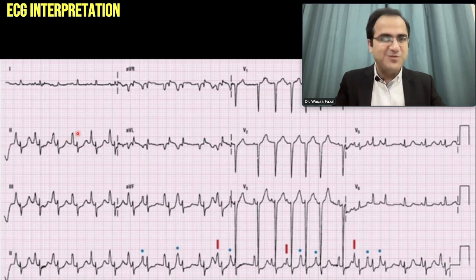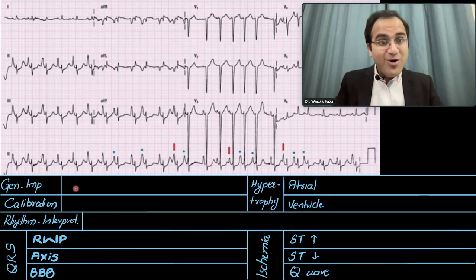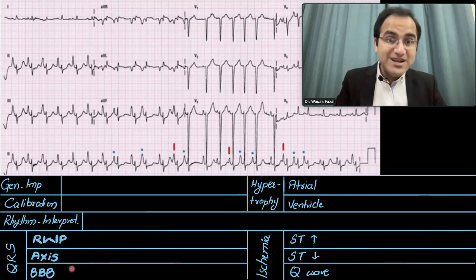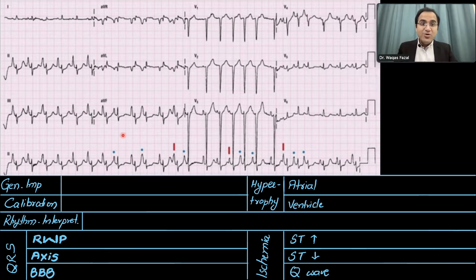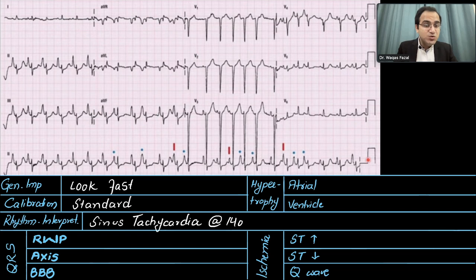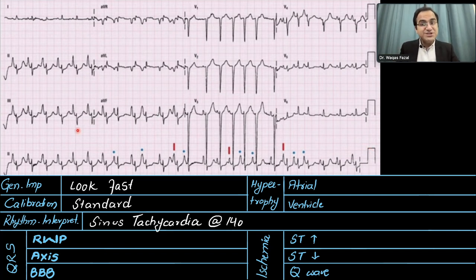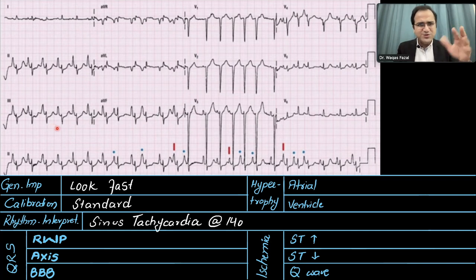Now we will practice some ECGs. In this ECG, there are clear-cut tall peaked P waves. We will solve the ECG by the six-step method. Coming to the general impression, the ECG looks fast. Looking at the calibration, it should be two large boxes tall and one large box wide, which is the case — so it is a standard calibration. The ECG is being printed at 25 mm per second, which is standard.